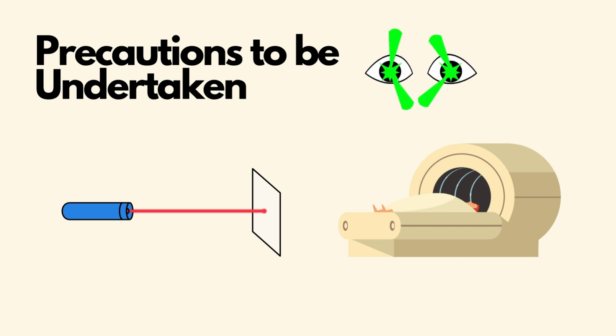Place foams between the patient and the bore wherever a portion of the body comes in contact with the bore. Ensure that the patient does not touch the magnet bore. Orient the patient, head first or feet first, to minimize the length of the cable in the bore. For larger patients, use wide patient straps to secure the arms, preventing them from touching the bore.